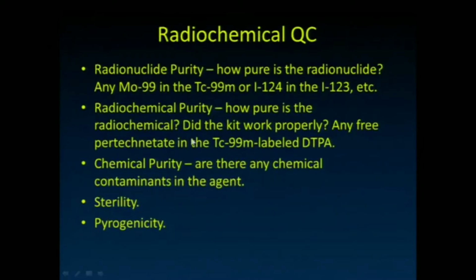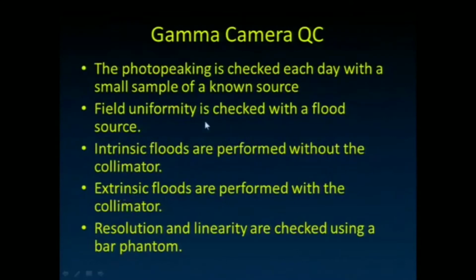We always want to check our radiochemical purity, and I won't read these to you. The radionuclide purity, radiochemical purity, the chemical purity, certainly want to make sure our radiopharmaceutical is sterile as well.